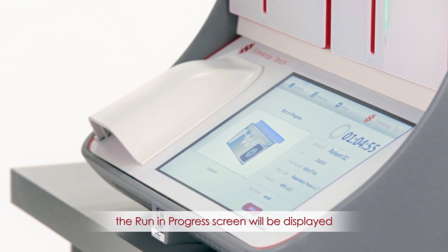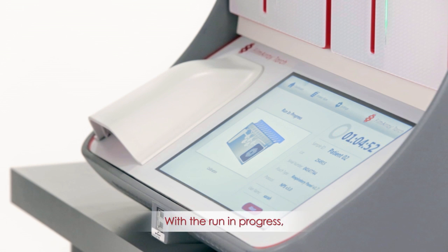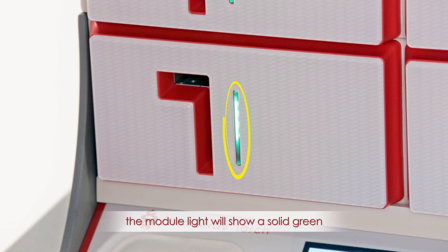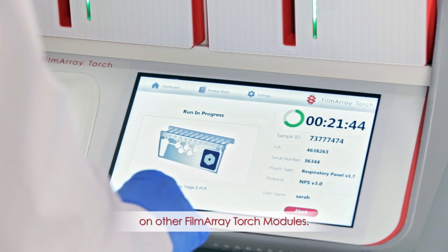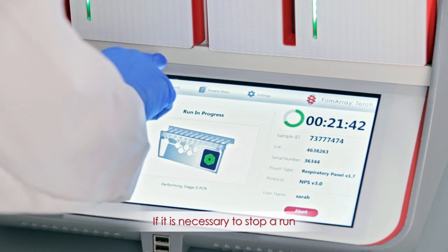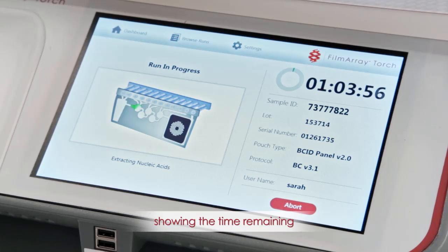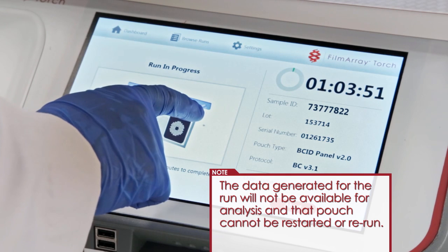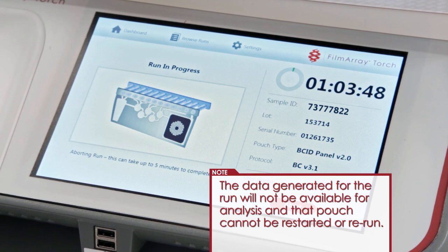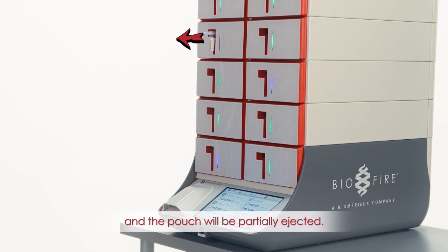Once started, the Run in Progress screen will be displayed with the approximate remaining run time. With the run in progress, the module light will show a solid green, and the operator may navigate to the dashboard and perform tasks on other FilmArray Torch modules. If it is necessary to stop a run before it is complete, select the applicable FilmArray Torch module from the dashboard showing the time remaining and select Abort. Note, the data generated for the run will not be available for analysis, and that pouch cannot be restarted or rerun. When a run is complete, the dashboard will display Finished, and the pouch will be partially ejected.